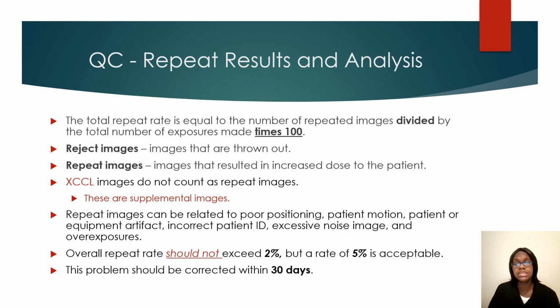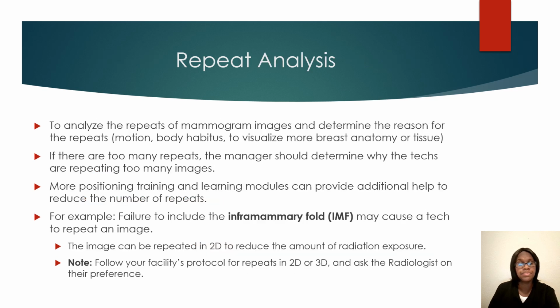Repeat images can be related to poor positioning, patient motion, patient or equipment artifact, incorrect patient ID, excessive noise on the image, or overexposures. The problem should be corrected within 30 days. The overall repeat rate should not exceed 2%, but a rate of 5% is acceptable.